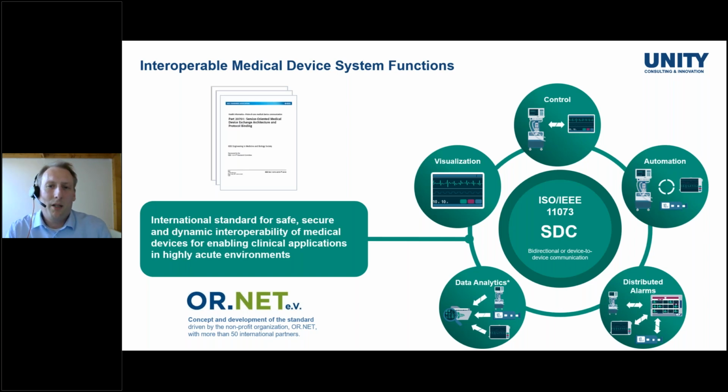that are now part of a German non-profit association called OR.NET. If you want to have more information on that, it's OR.NET. You can find it on the website. The association has the objective to foster interoperability within the hospital and has its roots in a number of research projects, I think starting in 2004, 2005.